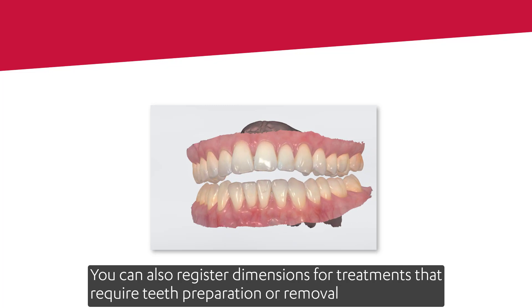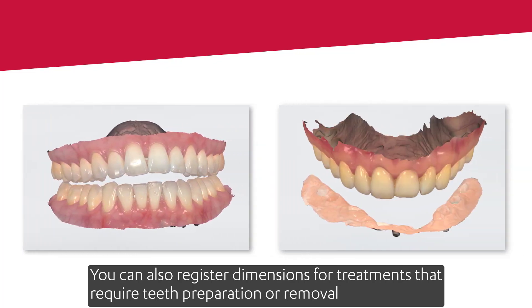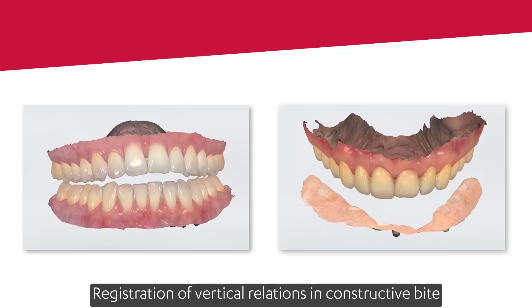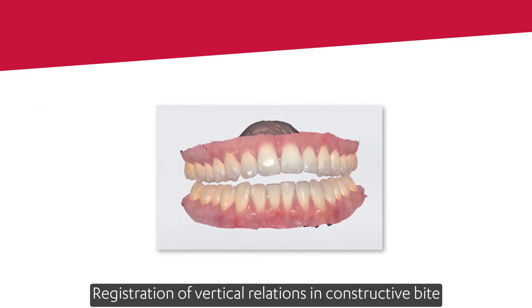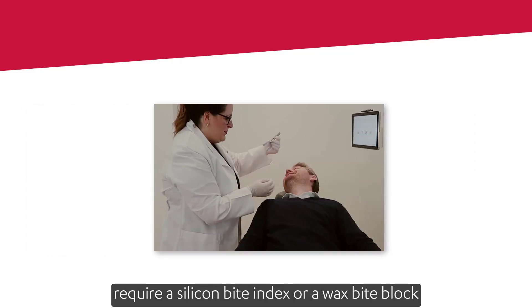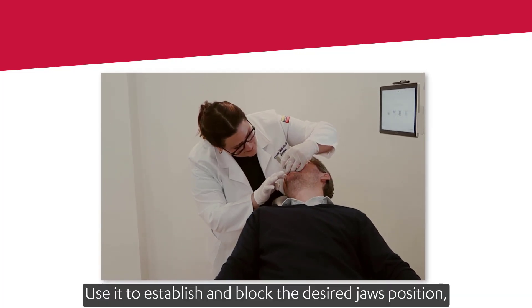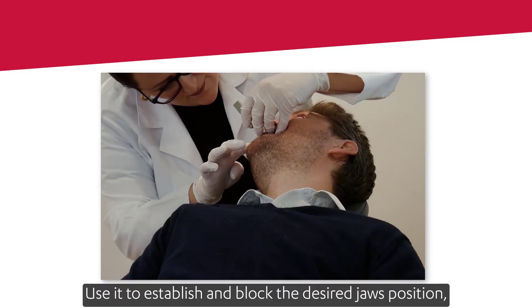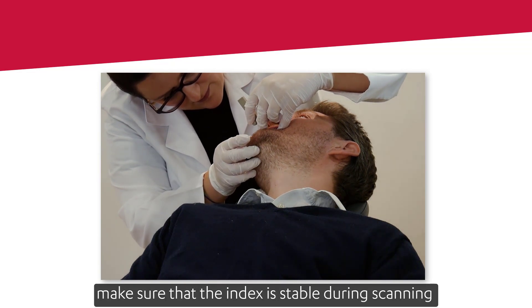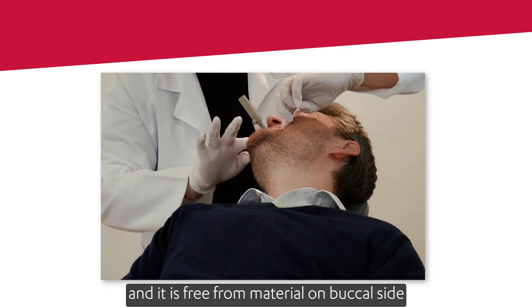You can also register dimensions for treatments that require teeth preparation or removal. Registration of vertical relations in a constructive bite requires a silicon bite index or a wax bite block. Use it to establish and block the desired jaw position. Make sure that the index is stable during scanning and is free from material on the buccal side.